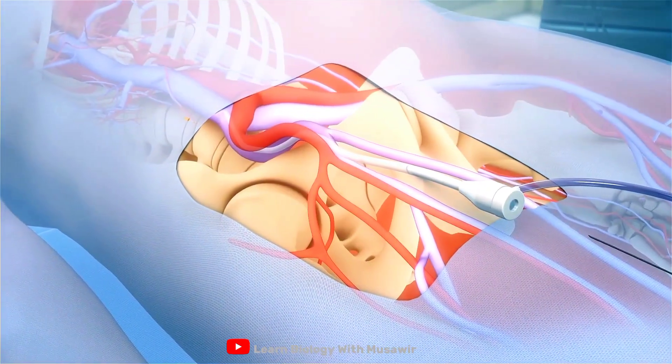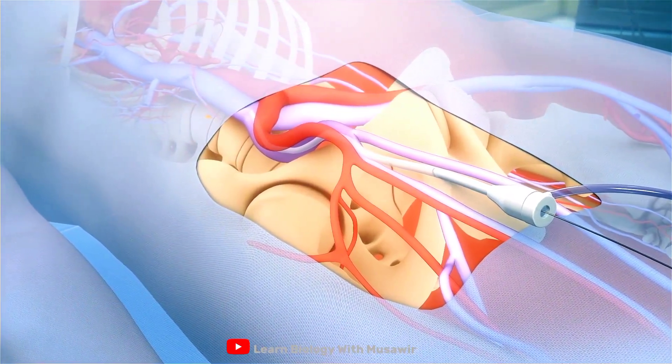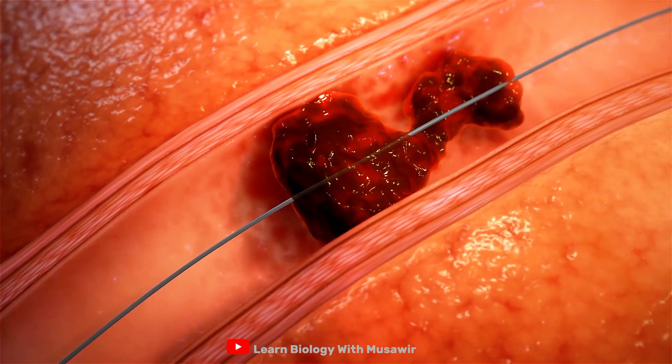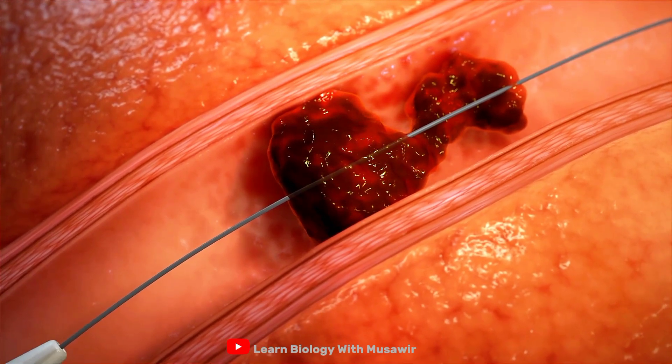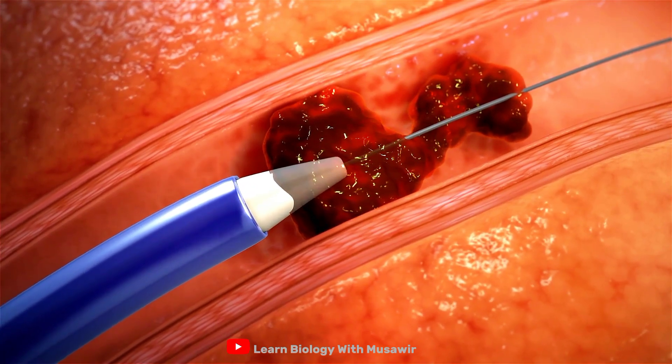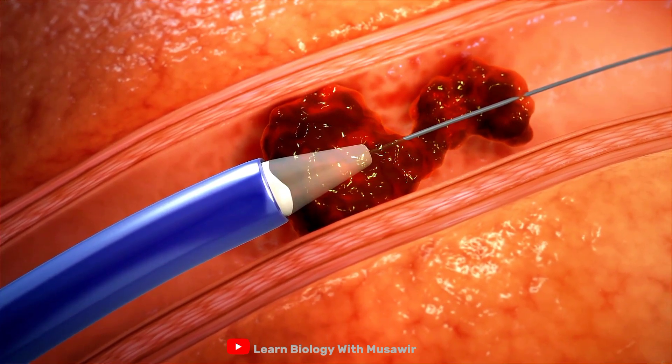Upon gaining ultrasound guided venous access, a guide wire is advanced past the target clot in the pulmonary artery. With the dilator in place, the Trever 20 is advanced over the wire until it reaches the target clot.